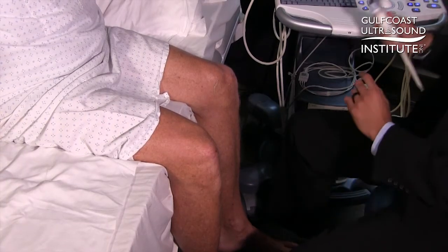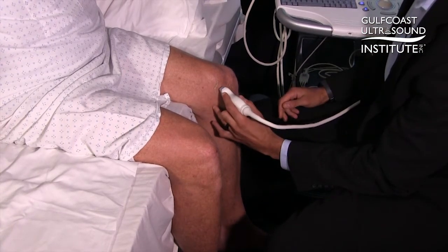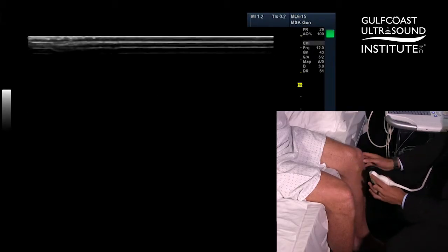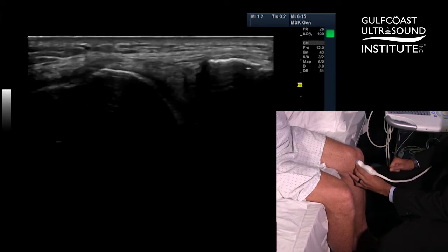When we're evaluating the medial meniscus of the knee, we want to position our ultrasound probe in long axis to the knee joint here on the medial aspect. It often helps to palpate the medial joint line just above the tibia and place your probe right over the medial joint line.